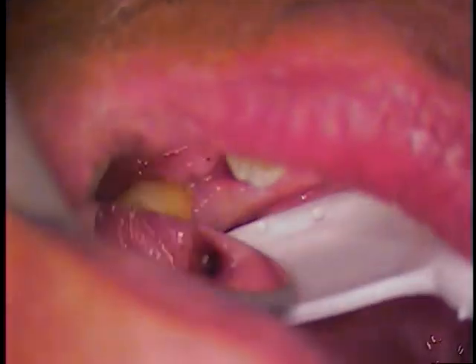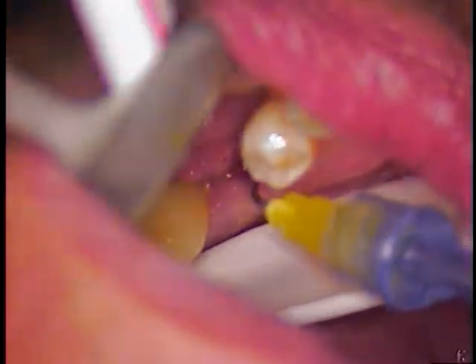All right, so from here on out, basically what we're going to do is, let me get in there before it collapses on us. I'm basically going to go in again. Let's rinse that out again.